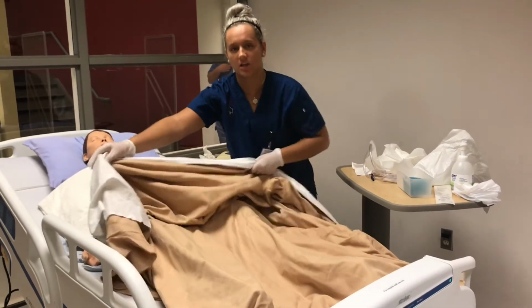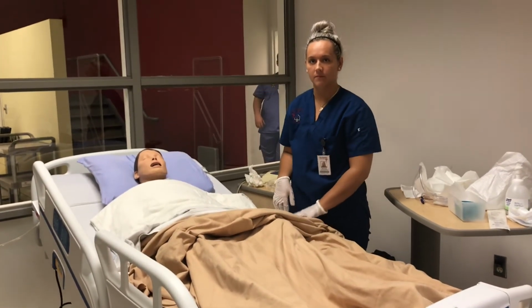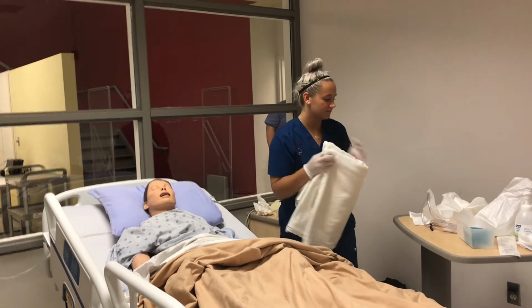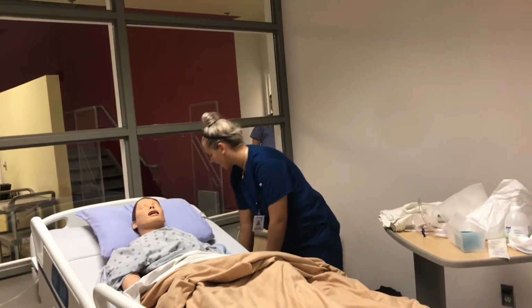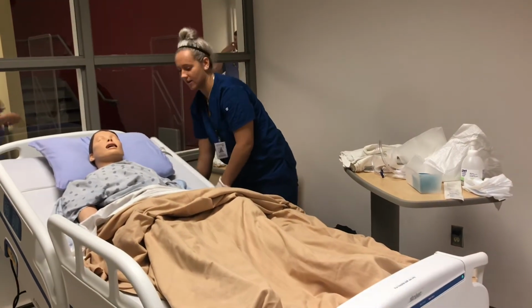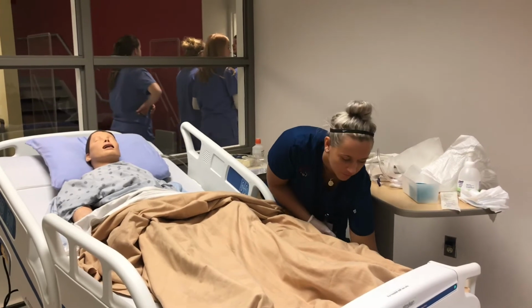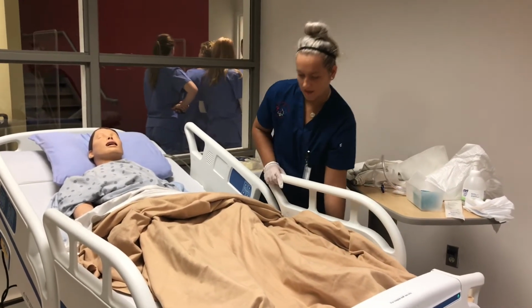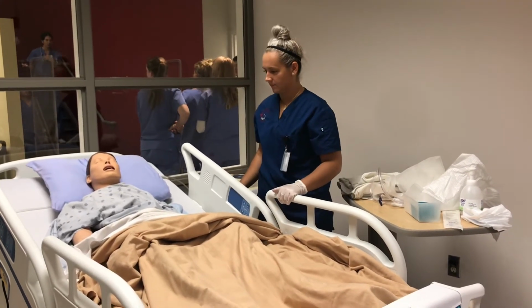The necessary peri-care would be provided after the procedure is done. Then you're going to want to put the arm rails up as they were before for safety. And then you're going to want to lower the bed.